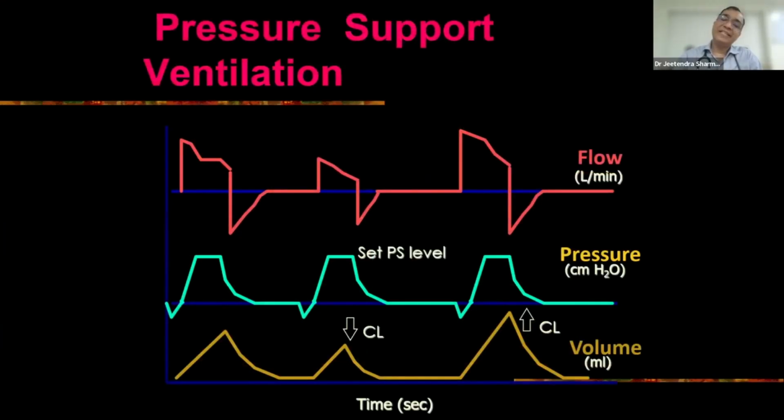So you understood, and the same problem with pressure support which I already narrated with the pressure preset. If you keep the pressure set, then if the lung becomes stiff, volume goes down. And if the lung becomes very elastic, your volume goes up. Both can be very dangerous. Say, for example, everything is fine. Suddenly your patient has significant secretions in the lungs, so the pressure rises. The ventilator understands, okay, my limit has been achieved.